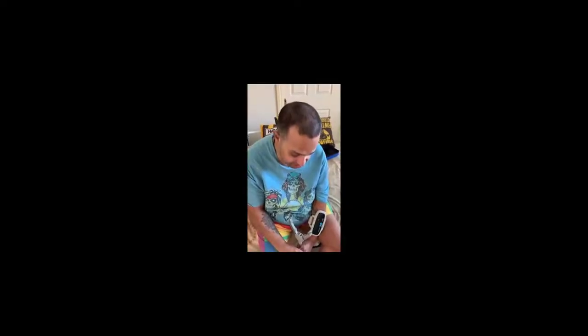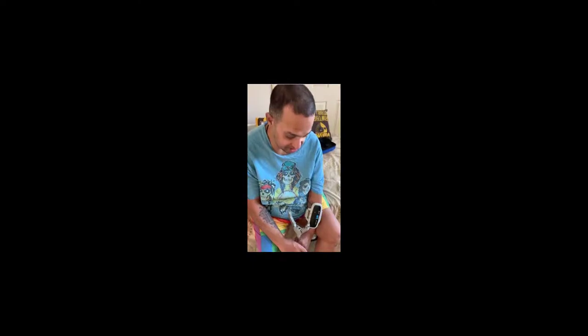I'm going to attempt to lift up my pickup stick for the first time 6 years after having a major ischemic stroke. My brain is doing this on its own. There's no triggers, there's no timers. I have to go through all the brain damage, 33%, to send the message to my left hand. So I'm relaxing my shoulder, my forearm. On a count of 3, I'm going to lift the stick up. So 1, 2, 3.